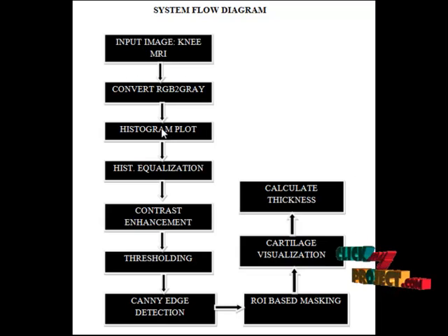The vertical axis represents the size of the area captured in each of these zones. Thus the histogram of a very dark image will have the majority of its data points on the left side and center of the graph. Conversely, the histogram of a very bright image with few dark areas or shadows will have most of its data points on the right side and center of the graph.